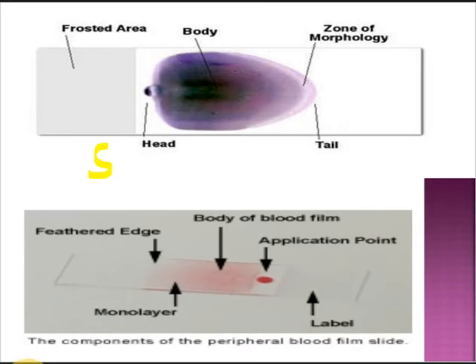Now, this is your smear, guys. This is the very popular peripheral blood smear. Yes. Okay. So, yeah, this is really hard to do, guys. Basically, when I was still a second year, third year, fourth year student, I was actually having a hard time perfecting the smear because it's really hard. I don't know. I tried many techniques, guys, but yeah, I guess you can't have everything. Joke, right? There's always a catch.